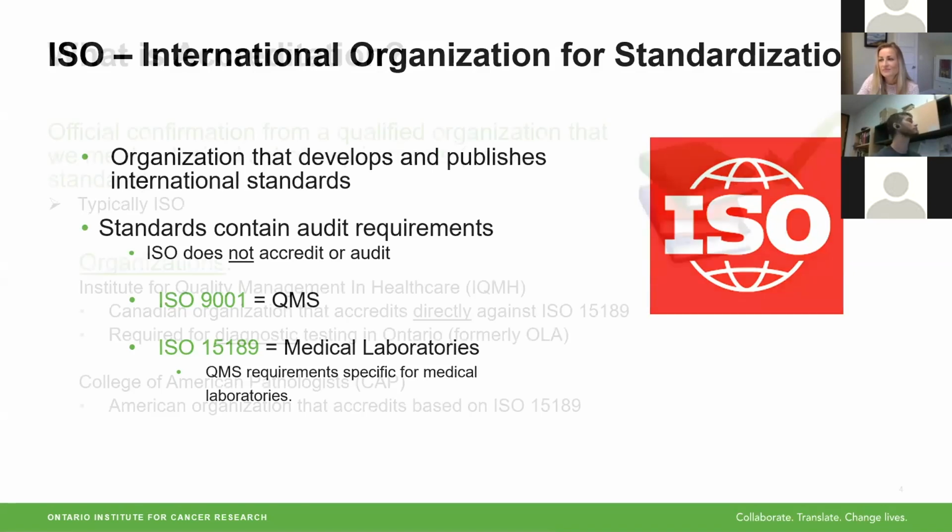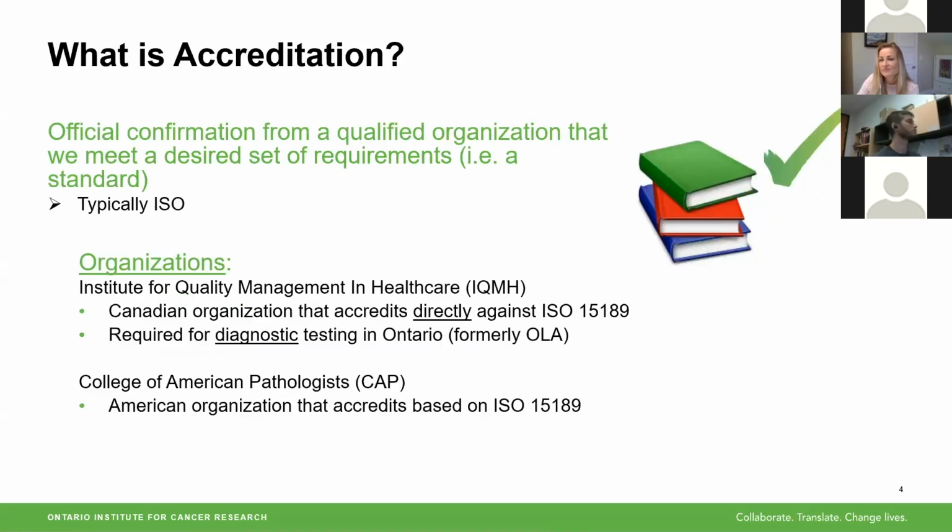So the two organizations that are going to accredit us are the Institute for Quality Management in Healthcare, or IQMH. This is a Canadian organization that will audit you directly against ISO 15189 requirements. Like they'll come in with the standard as a checklist and check you for compliance with that. So if you're going to do any kind of diagnostic testing in Ontario, you need to have this. And this was also formerly the Ontario Laboratory Accreditation.